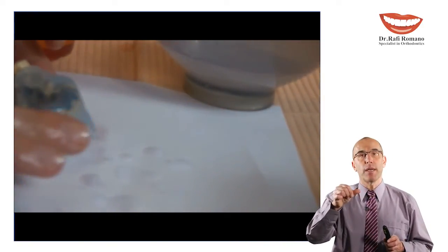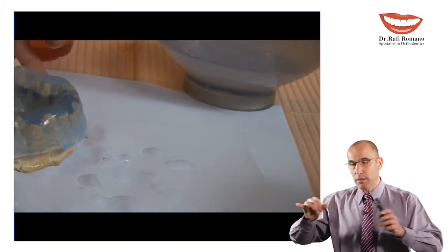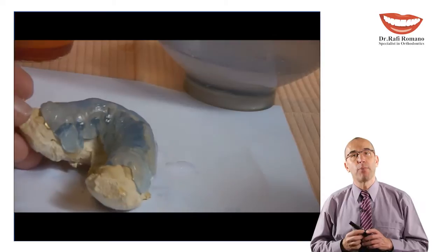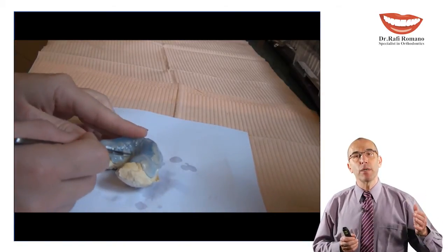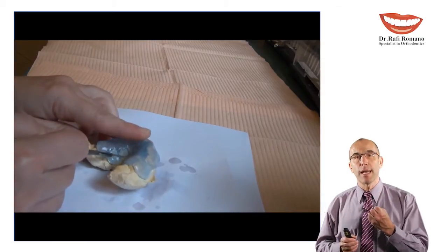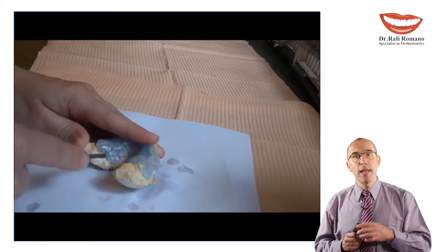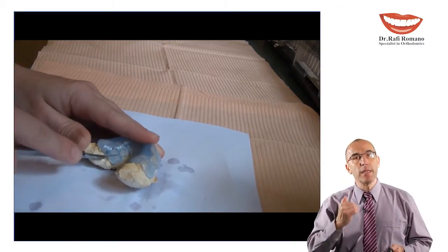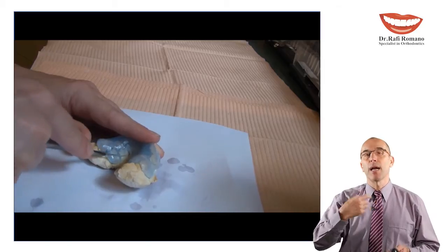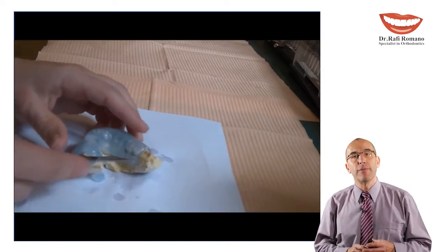Make sure that the Memosil enters behind and above all the brackets. Then we let it stay for an hour just to cure nicely. You can do it even half an hour. Then with the scalpel, she cuts the tray nicely, lingually and buccally, to make a very nice tray that we can deliver to the mouth.